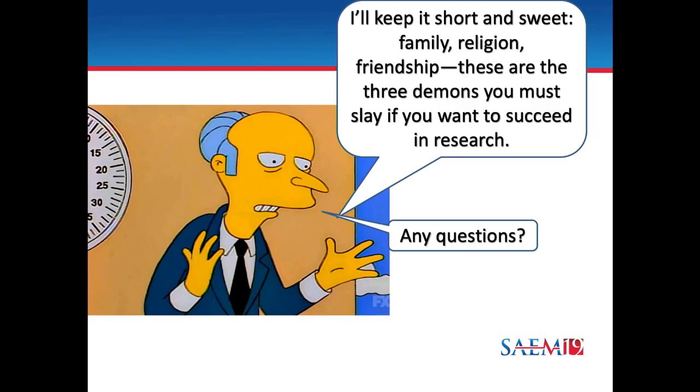So, yeah, really good question. Even in really sick patients who have good images, it can be a challenge when they have a lot of respiratory distress. A high respiratory rate, high minute ventilation, and a high heart rate can limit it. So we found in our study, the first time we published, we actually did that. We had an inter-rater reliability and a quality score. What we did was we scored the tissue border or the blood tissue definition. We had an independent cardiologist look at it, give it a 1, 2, or 3. And then the tracking system will actually give you a check mark or an X if it feels it's adequately tracking the segment.